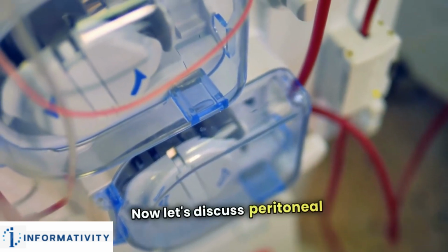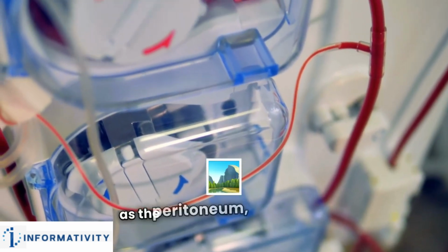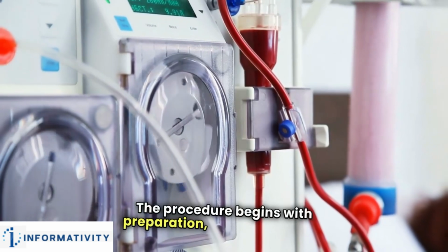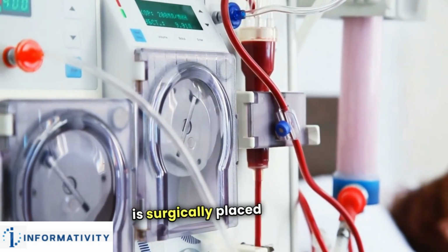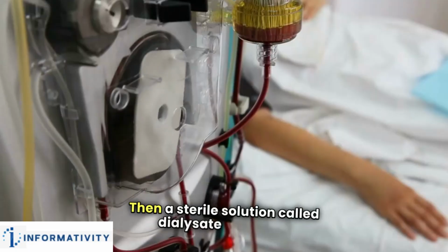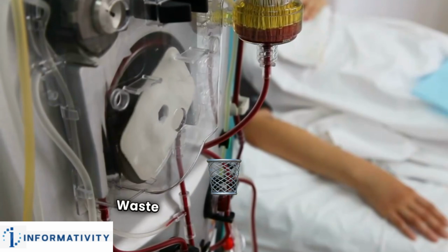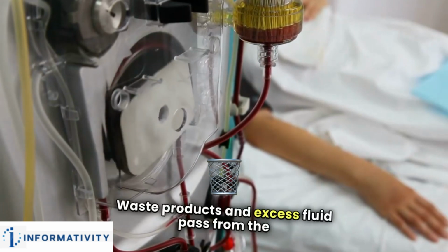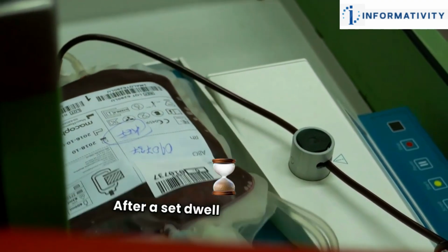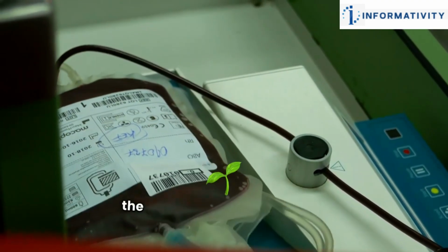Now, let's discuss peritoneal dialysis, which uses the lining of the patient's abdomen, known as the peritoneum, as a natural filter. The procedure begins with preparation, where a catheter is surgically placed into the abdominal cavity. Then, a sterile solution called dialysate is infused into the abdominal cavity through the catheter. Waste products and excess fluid pass from the blood vessels in the peritoneum into the dialysate. After a set dwell time, which lasts several hours, the used dialysate is drained out through the catheter and replaced with fresh solution.